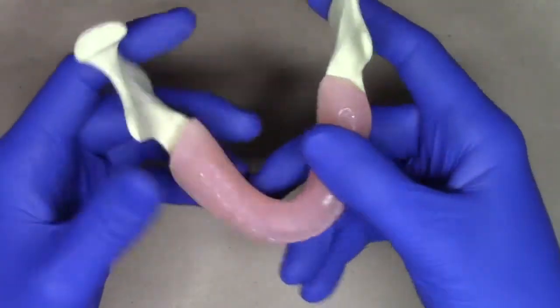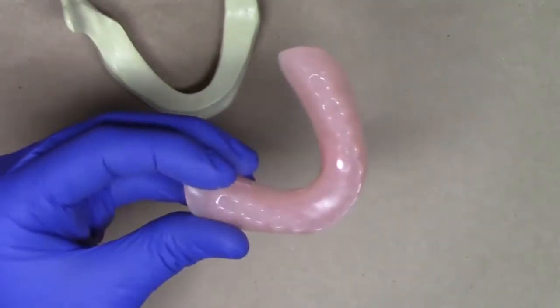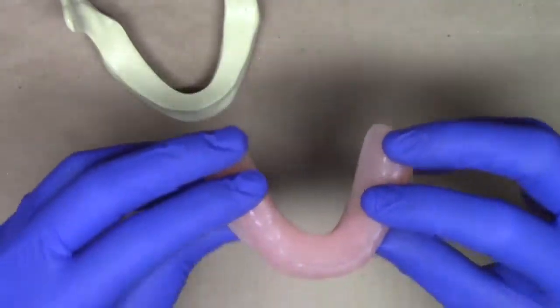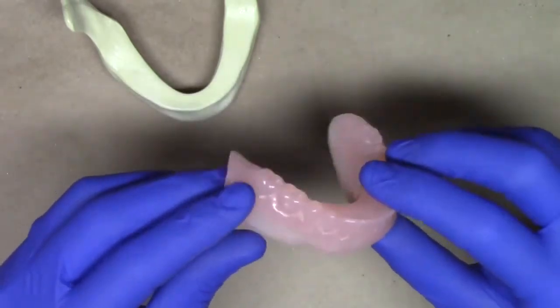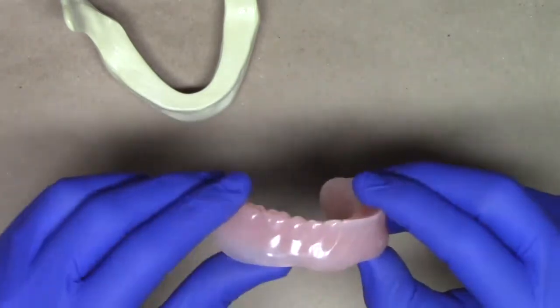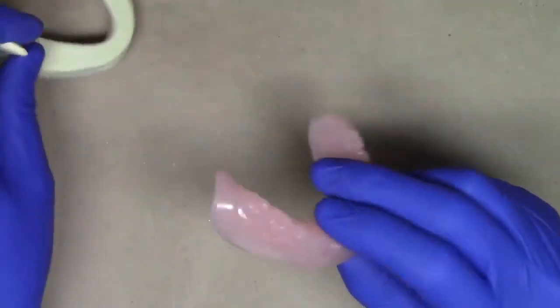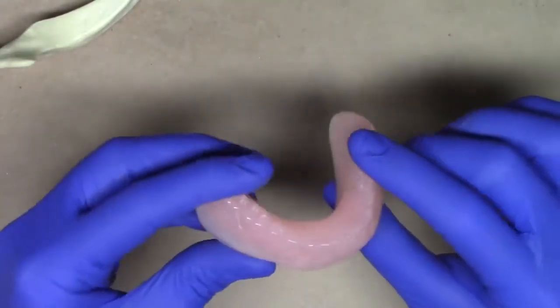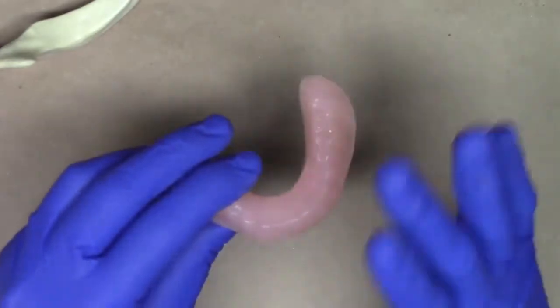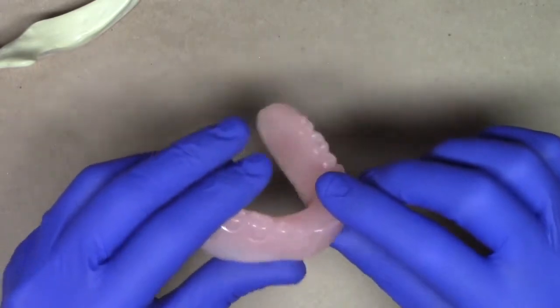What we're going to do is evaluate the patient's complete denture, and we're going to duplicate this into our clear duplicate. The first step is we remove the denture from the mouth and inspect it everywhere. We're going to verify that the denture is properly fitting as well as clinically acceptable. First and foremost, we want to make sure that it fits on the alveolar ridge. The patient is satisfied with the aesthetics as well as the function of the complete denture. Once all of those things have been verified, we know that this is an adequate complete denture and we're ready to move forward with the LODI preparation.